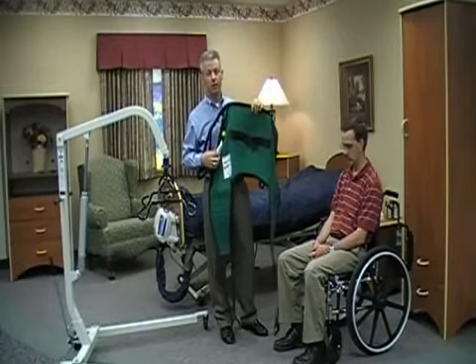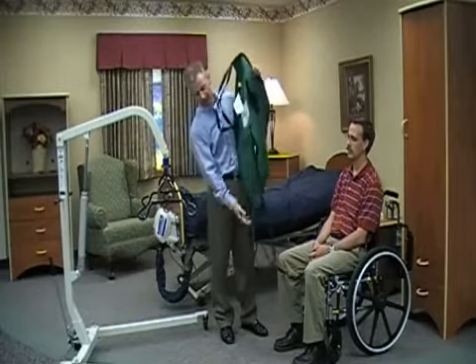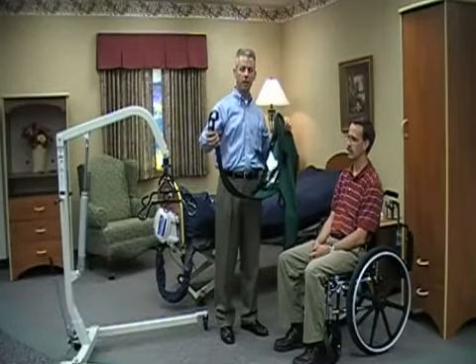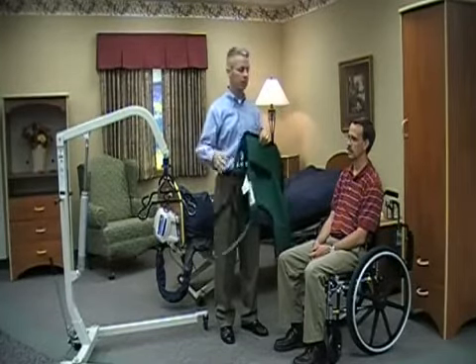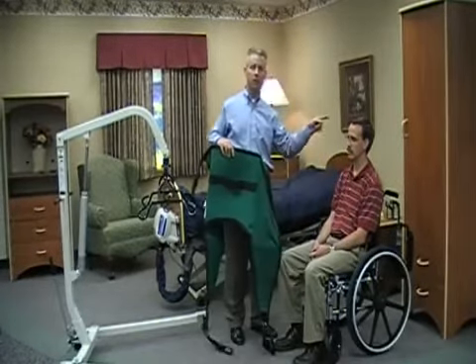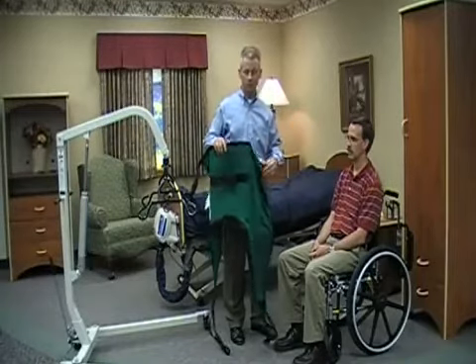Each of the slings has four straps — there are straps on both sides for the shoulders as well as both legs. For convenience, I've removed one of the arms of the wheelchair so that it'll make it easier for you to see me fitting the sling appropriately, but in most cases, you'll have an arm on both sides of the wheelchair.